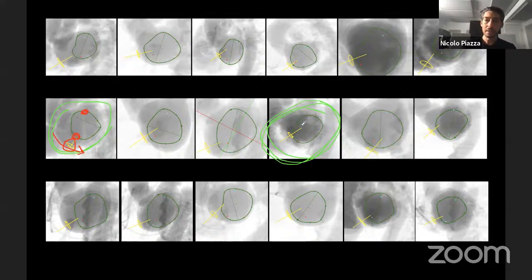On the other hand, you can see in this case where it may be more important whether you puncture superior or inferior. Okay, notice where the commissures are here. They're completely disjointed compared to where the commissures are relative to this atrial septum.